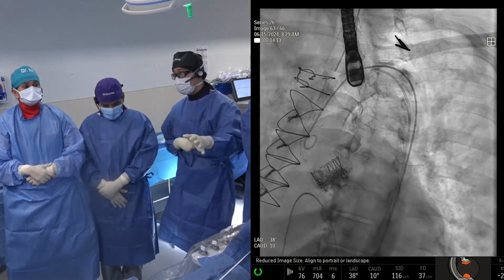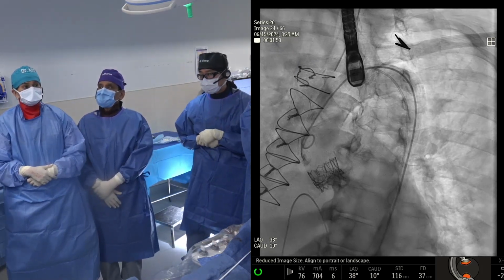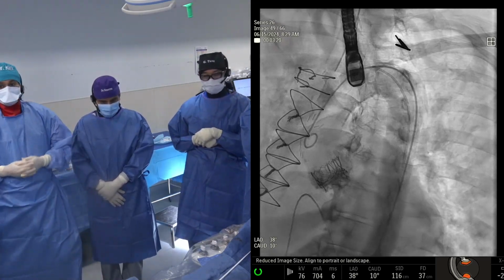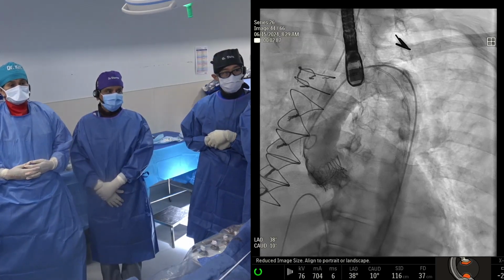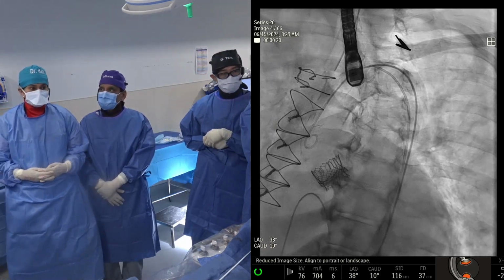So CT is helpful, but we still look at the aortogram as a final tiebreaker for a lot of these procedural planning decisions. All right. Any other question? Yeah. We do think that was a great choice. And what you have as a result, clearly, is that lifetime management is a reality. When you just put this balloon expandable valve in valve, you have zero gradients, and you have an option forever open.